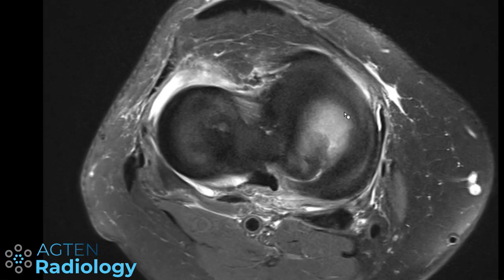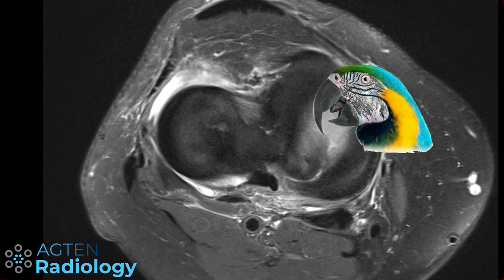And we can nicely see here the meniscus. We have here a radial component, which is then changing its orientation into a more longitudinal tear, vertically oriented. And this is a flap, because we have this tear here. The portion of the meniscus here flaps or dislocates a little bit in this direction. And this is called a parrot beak tear.